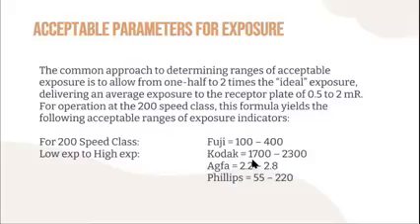Okay? So for Kodak, 1,700 to 2,300, that means the interval is 300. So what is the median pixel value here? It is 2,000. So 2,000 minus 300 because of the interval. If there is an interval of 300, you subtract it from the median pixel value, which is 2,000, which results to 1,700. Okay, that is the start of the range. And then it is overexposed if it is more than 2,300. So for Kodak, the interval is 300. If you subtract 300, that means it is underexposed. If you add 300, that means it is overexposed.